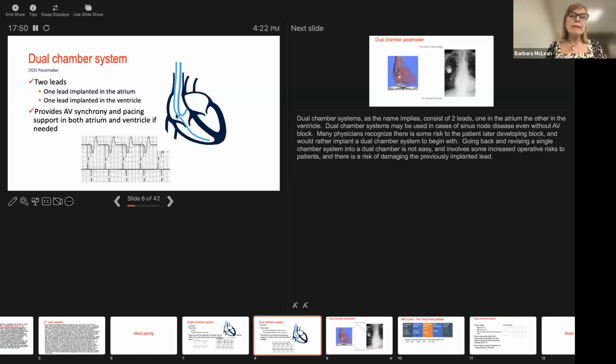So there's a lead that's implanted in the right atria and another lead that's implanted in the right ventricle. When we go back and review what the chart says, looking at the X-ray, it shows that the lead is in the right atrial wall and the other lead is in the apex of the right ventricle. Can't evaluate microperforation, but we don't have a big perforation. If we had a big perforation, we'd have a cardiac tamponade. So you might have some small perforations.